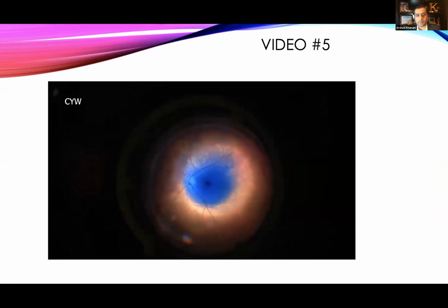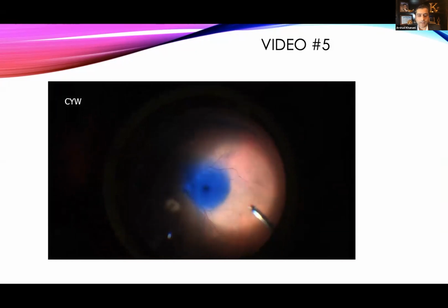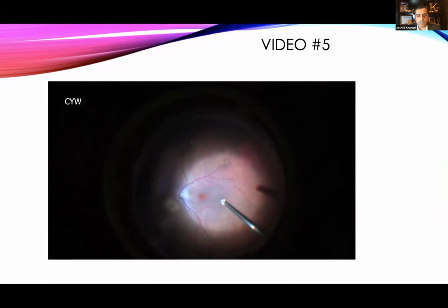Great settling because of the PEG. You can see you don't have to worry about, am I going to get a stain? It's more about letting it sit for 30, 45 seconds to a minute max. If you sit for a minute, I think it's going to be a really good stain. And then you can see here, she's removing it, and you can see the staining.